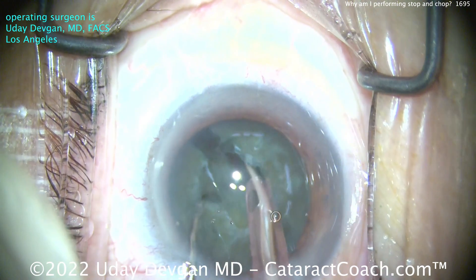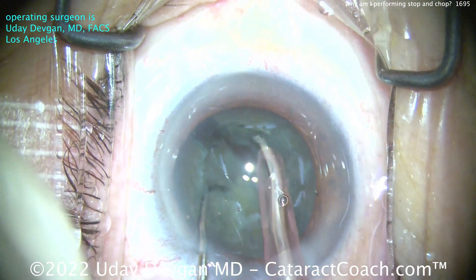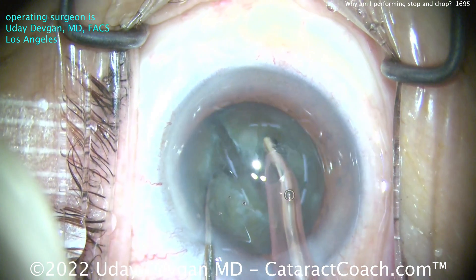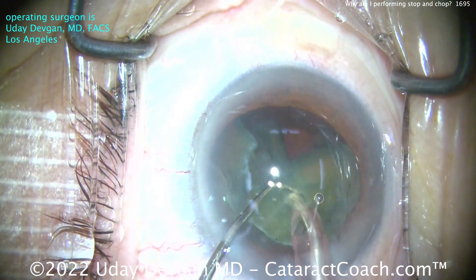And now we can use the FACO with high vacuum to chop. Bring those pieces up, get that piece up, and chop it.